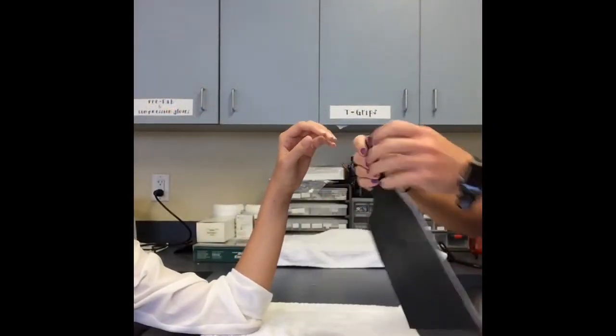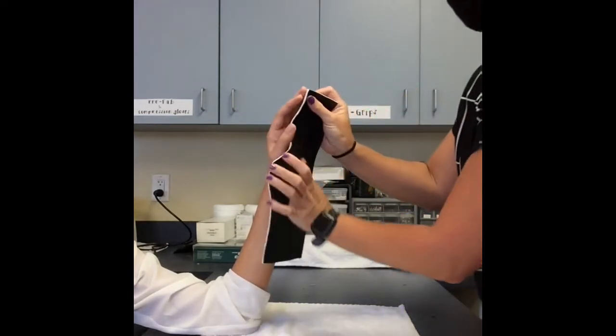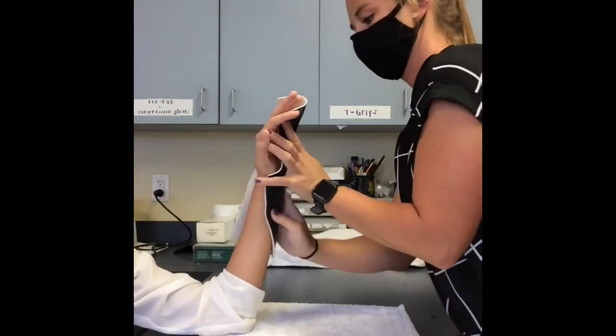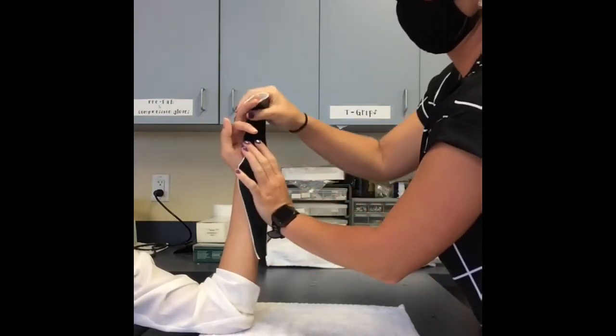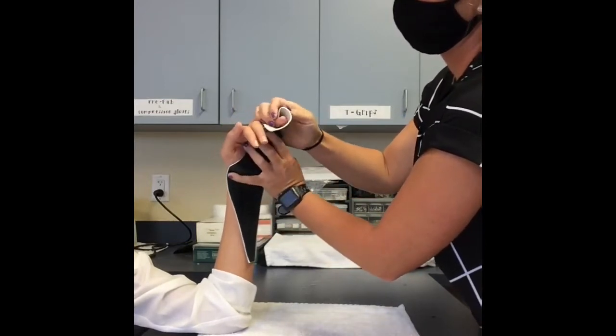Ensure that your patient is in an intrinsic plus position, or as close as you can to 70-90 degrees of MP flexion, with the PIPs and DIPs in full extension, forearm in neutral, and the wrist slightly extended. The thermoplastic should cover the full length of the involved digits, both dorsally and volarly, and it should travel dorsally along the carpals.